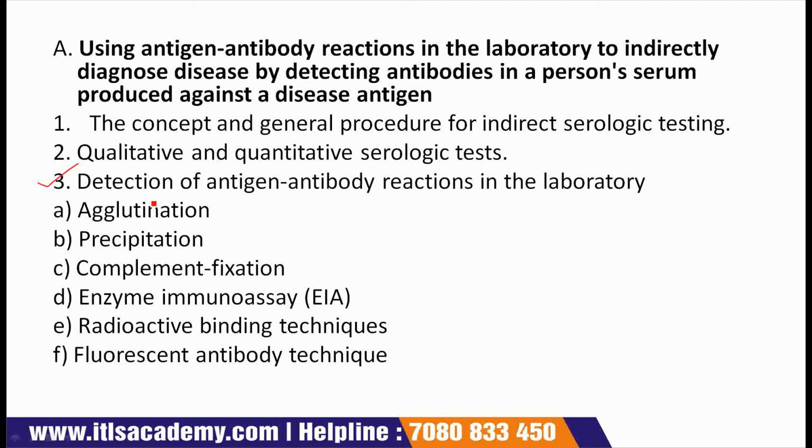Next point, detection of antigen antibody reactions in the laboratory. Indirect serological tests may be qualitative or quantitative. A qualitative test only detects the presence or absence of specific antibodies in the patient's serum and is often used for screening purposes.